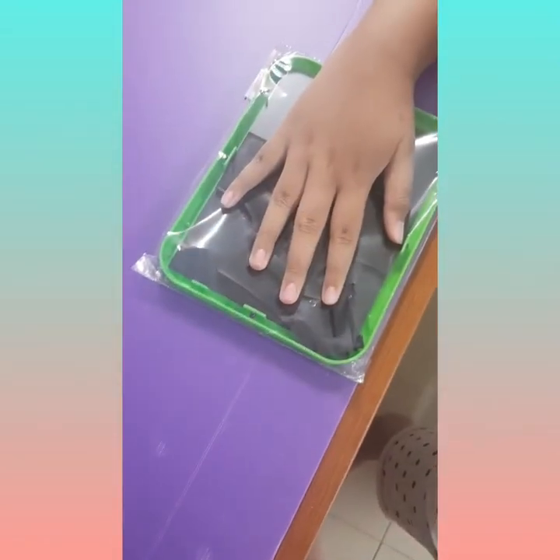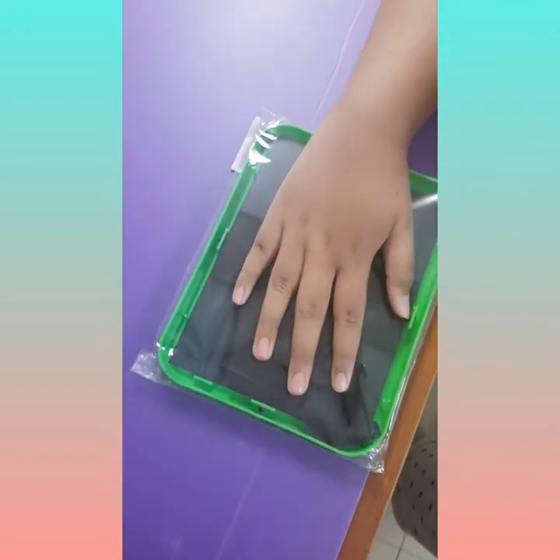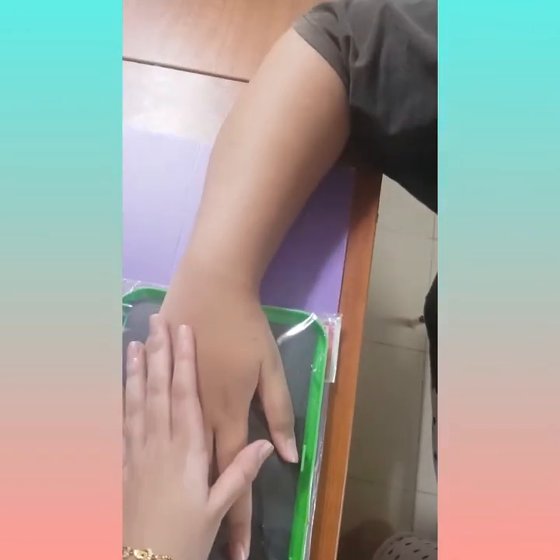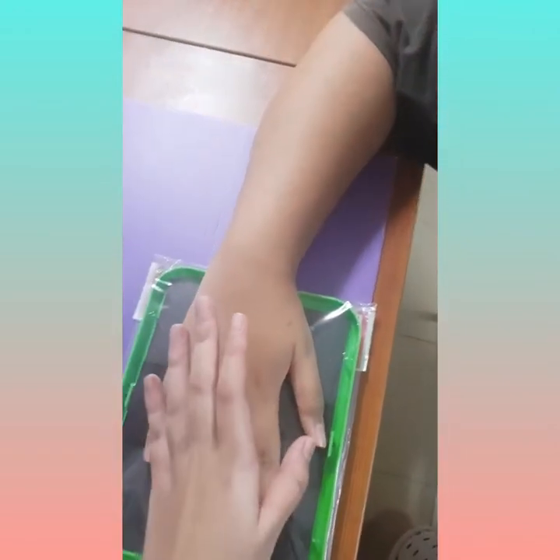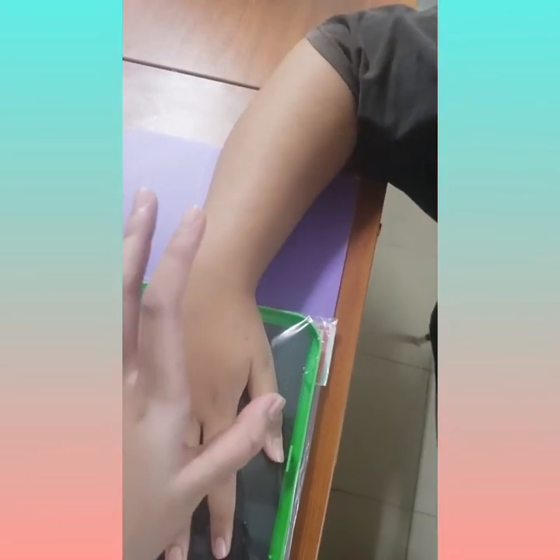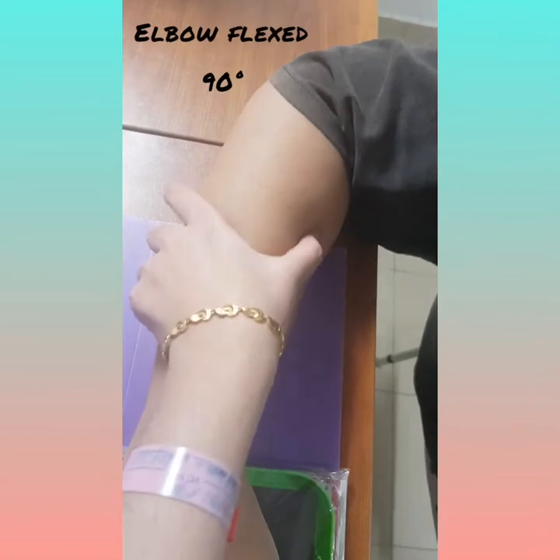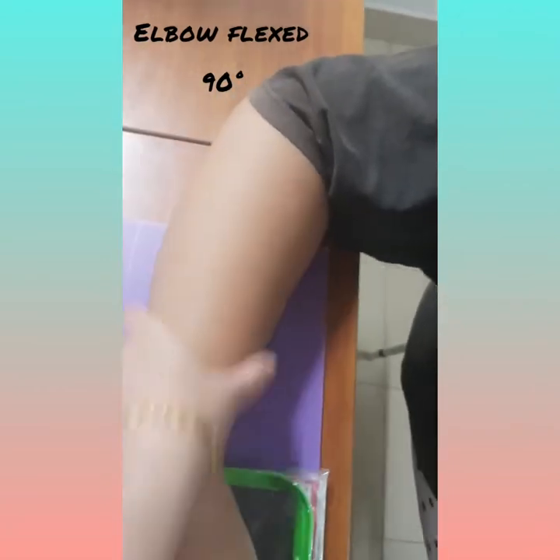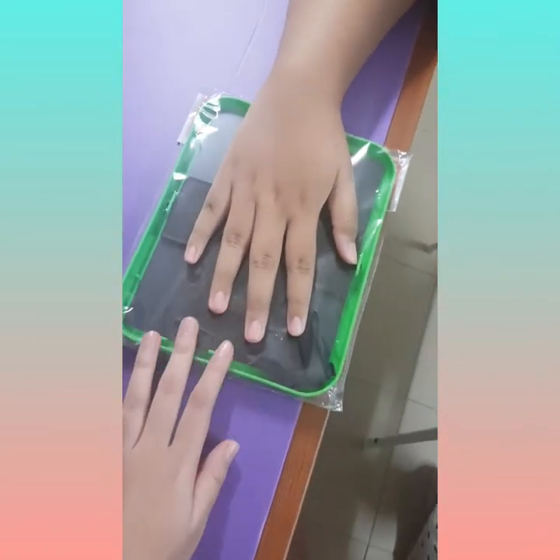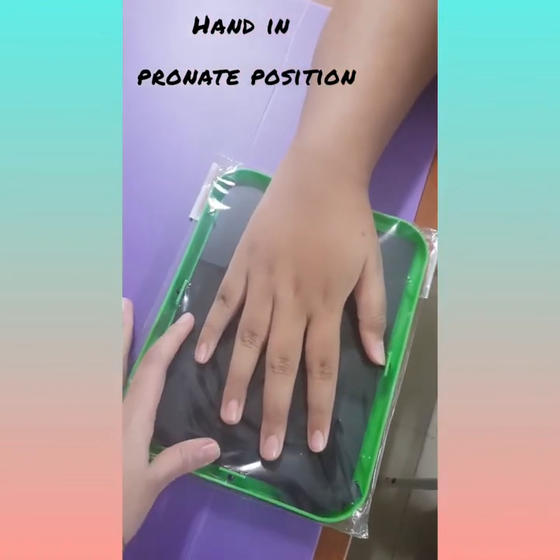Now we're at the table. The patient is seated alongside the table. The affected arm is placed and the elbow is flexed 90 degrees. The hand is pronated onto the IR.